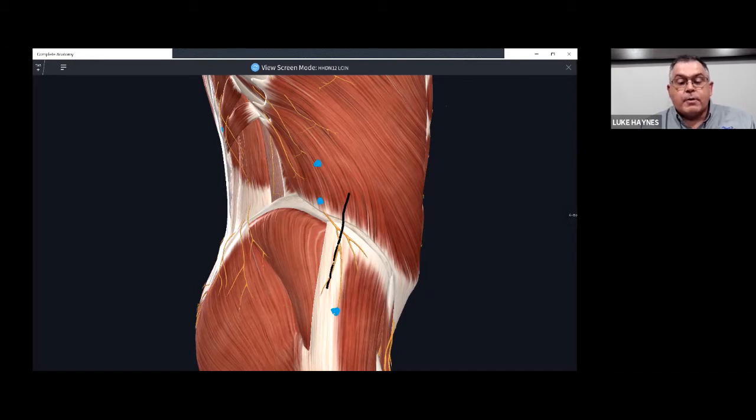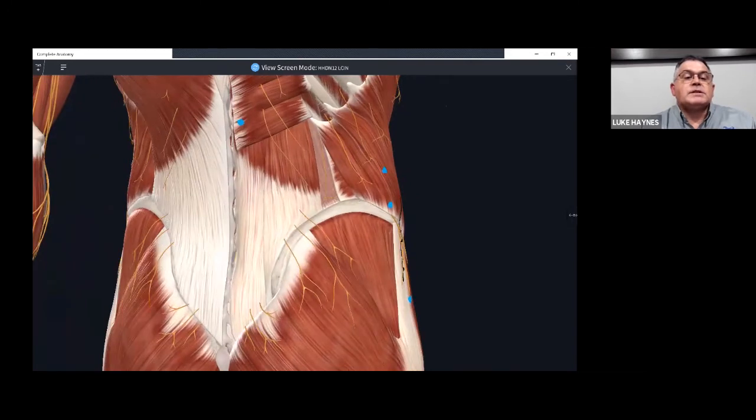Again, this can be a direct approach, or more likely we can thread through those contents from the anterior to posterior or posterior to anterior direction. Lastly, we can come up into the segmental level L1 for multifidus and longissimus.